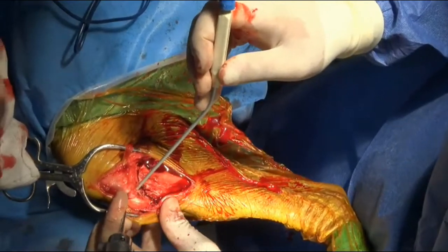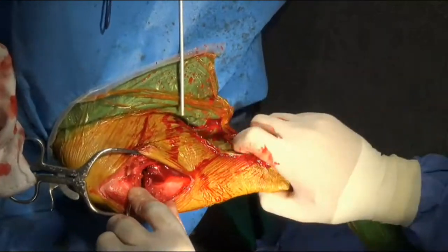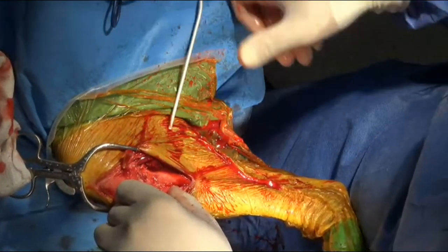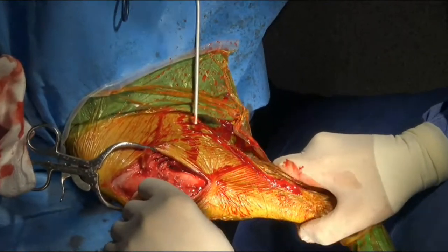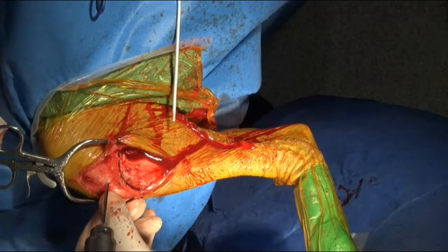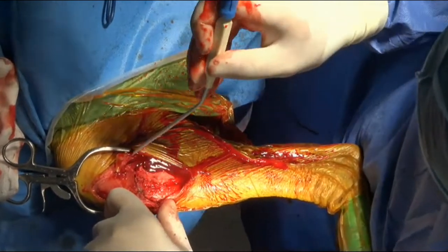So we're going to get the pin driver next. I'm going to get an 062 pin. And I'm going to need the point-to-points, please. And because it's something I don't do as often as a TPLO, I do find it a little bit awkward, just getting everything lined up how you want, making sure everything's sitting exactly how you want it. The big speed lock ones, if possible. So the first thing we're going to do here is actually put a headless compression screw through the cranial tibial apophysis into the proximal tibia.